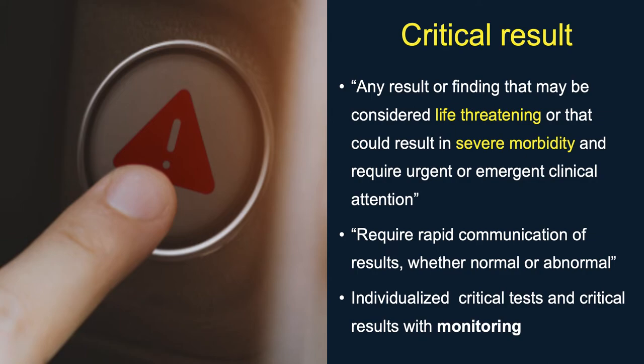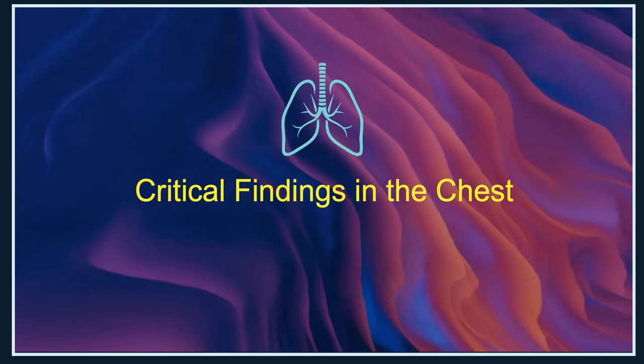Each facility has leeway to define its own critical tests and results, and thus there is really no standard list for either category. But what is essential is that it requires rapid communication of results, whether normal or abnormal. So now we tackle the critical findings in the chest.